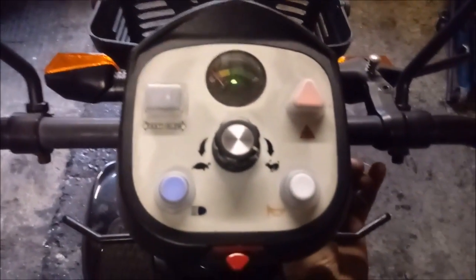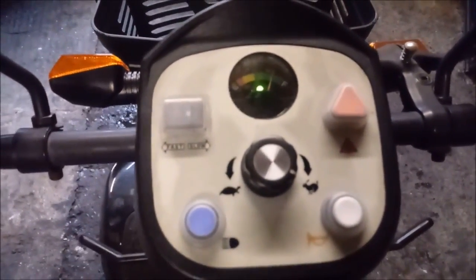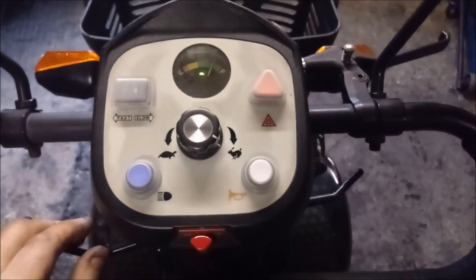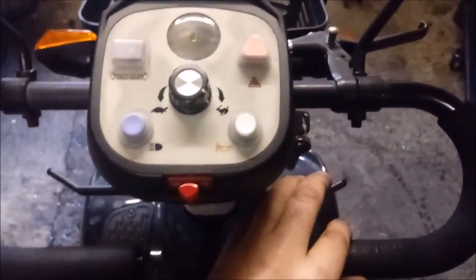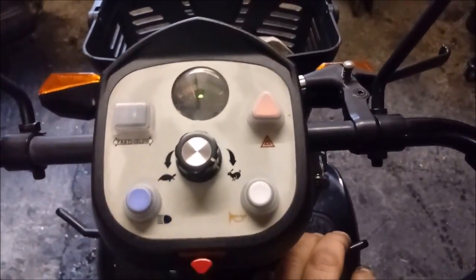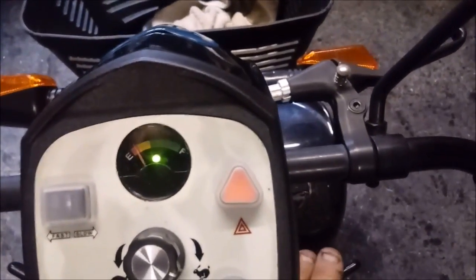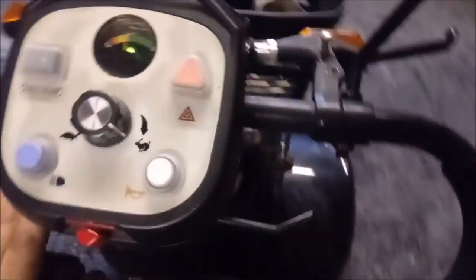And he says, right, if we turn the key on, it comes up initially to quite a high charge, but then tends to drop off quite quickly, especially when you're going forwards. See, I've only got to put a little bit of resistance on that wheel, and it goes right down to nearly 0, and it's just about got enough power to power itself backwards.